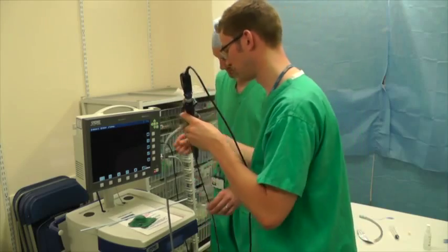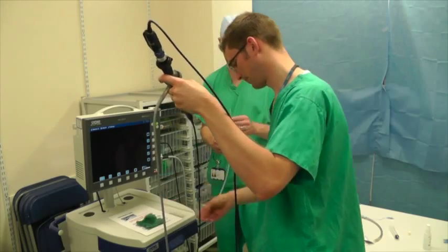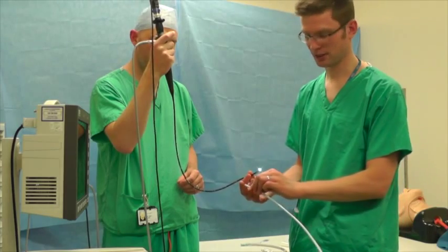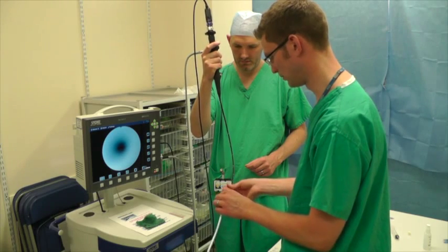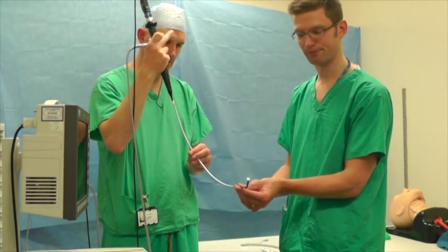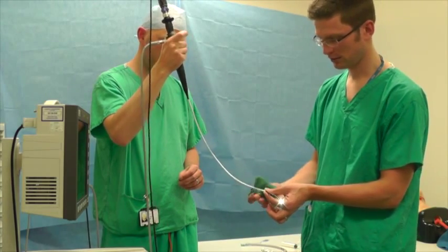Now we're going to lubricate the fibre-optic scope itself. You need to get loads of jelly to make sure your Aintree is going to run nice and freely — just avoid getting any jelly right on the tip, otherwise it affects your picture. Then, when passing your Aintree catheter, make sure you pass the proximal end onto the scope first, so you've got your distal end with the holes at the front. That should go nice and easily over your scope — railroad it all the way on, because if it's not on far enough you won't be able to move the driving tip. After that, lubricate your Aintree catheter as well, just to make sure it can pass through your iGel nice and easily. It's now ready to use.